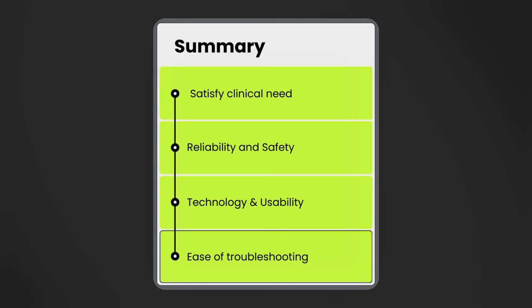They noticed that the positives were it was super user friendly, very easy to prime, and it was very mobile. Just like the Leva Nova Spark, the Breethe also did not have a heat exchanger, and the two large bore stopcocks on the oxygenator have popped off multiple times, which led them to stop using the Breethe system altogether. They also noticed that the console wheels are small and can get stuck in elevator spaces.